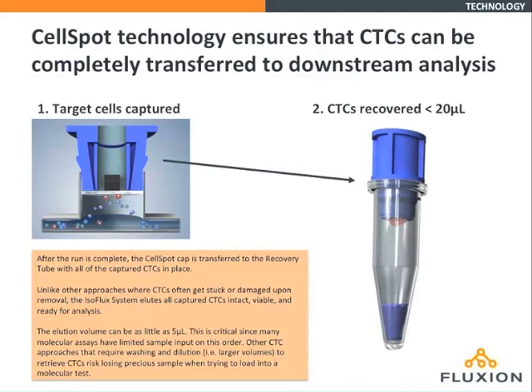But of course, that volume can include your reaction mixture for the subsequent assay. So we feel like this is a very efficient way of taking the cellular material and going further to the molecular analysis.